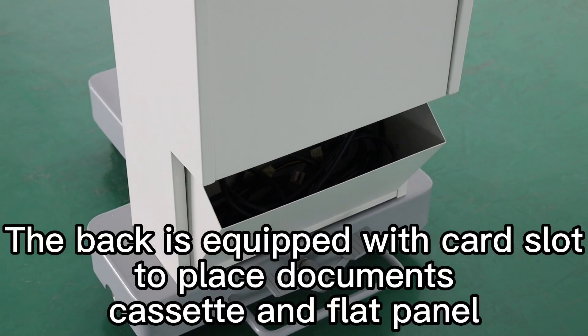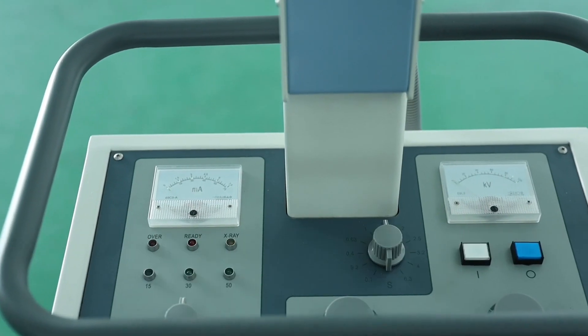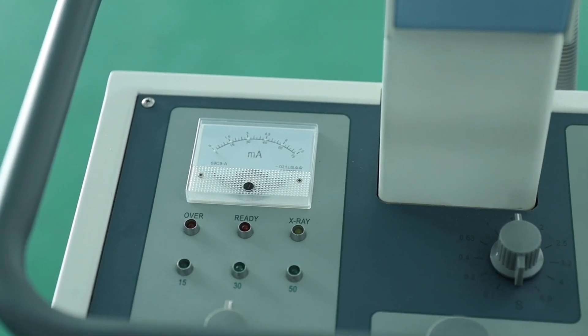The back is equipped with a card slot, to place documents, cassette and flat panel. The console interface is simple and convenient for debugging.